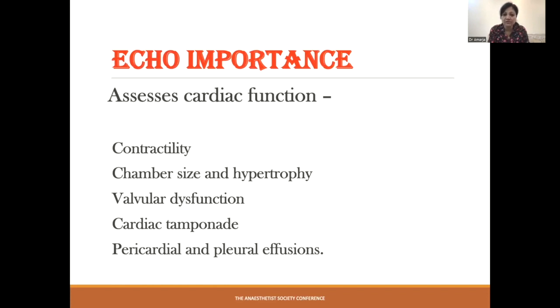It also assesses the chamber sizes and hypertrophy, which is very important while managing obstetric cases like peripartum cardiomyopathies. So we have to be very well versed with this, and a lot of information can be gained with echocardiography about the patient's condition. Then valvular dysfunctions, like the stenosis and the regurgitations, cardiac tamponade, very important, and pericardial and pleural effusion.